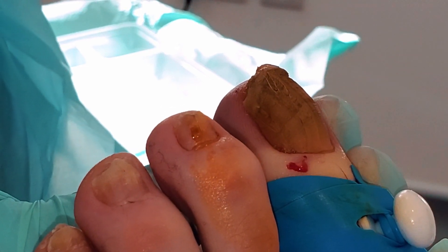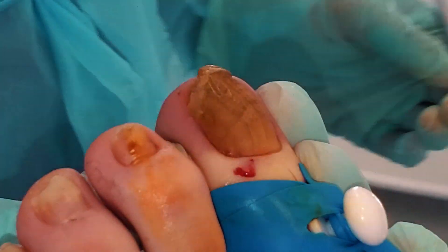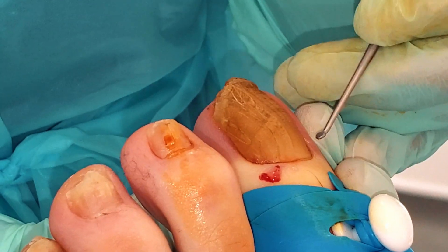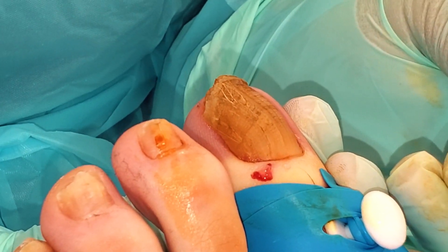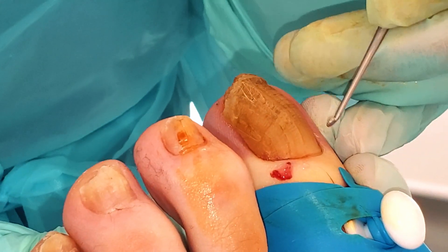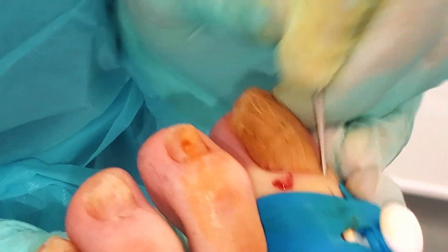What happened is he had an injury from football and the nail has been growing out a bit wonky, so we're going to try to remove it and see what happens afterwards. We're going to loosen the nail plate from the nail matrix. We've already done a local anesthetic and we have a tourniquet — or tunicade, whatever you guys want to call it — and that's to stop the bleeding. So we're going to remove this and it should be relatively easy because hopefully there's no pain.